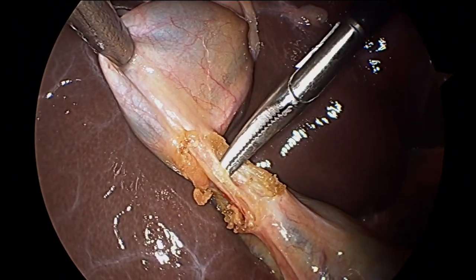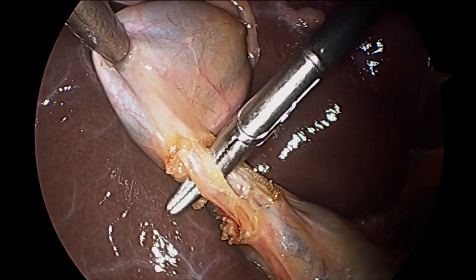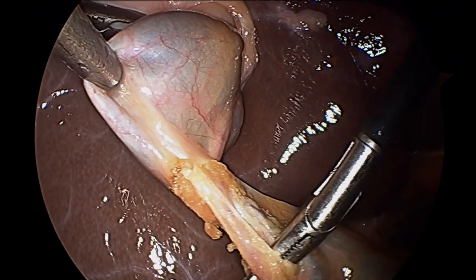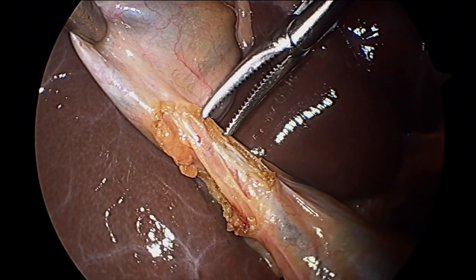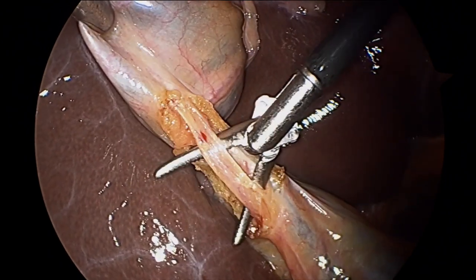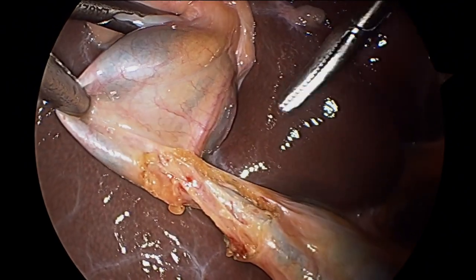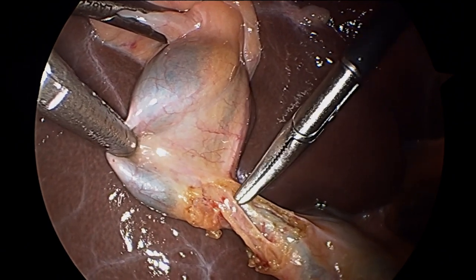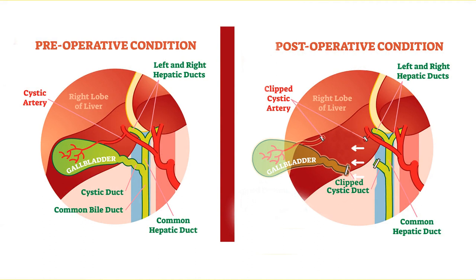Now you see a Maryland dissector used to define a branch of the artery that feeds the gallbladder. That artery brings blood containing nutrients to the organ. And behind that, you can see at the bottom of the screen, is a bluish structure. Dr. Helms is meticulously dissecting strand by strand to isolate the artery's branches and the duct to the gallbladder. That duct connects the gallbladder to the liver's biliary tree — essentially the plumbing that drains the liver's bile.